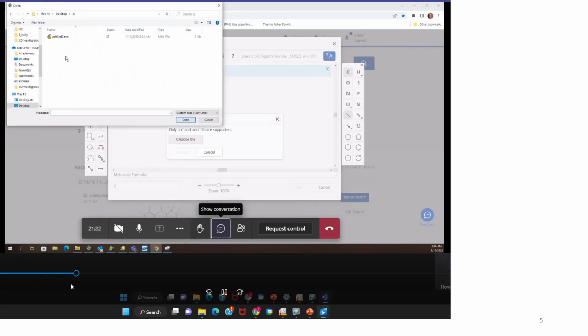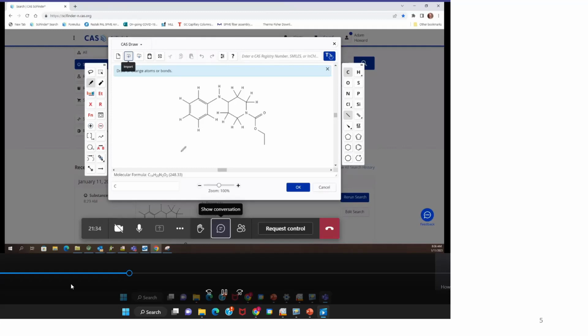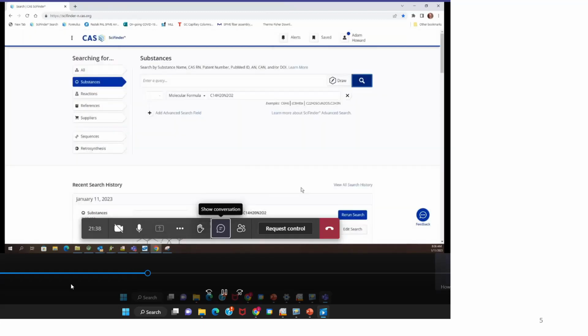We're going to go pick it and open it. You notice when we open the file that all of the sites that I wanted to block from having any connection are attached hydrogens in it. So I've allowed no branching in those for the exact or the substructure, and now we'll search with that structure with the molecular formula.